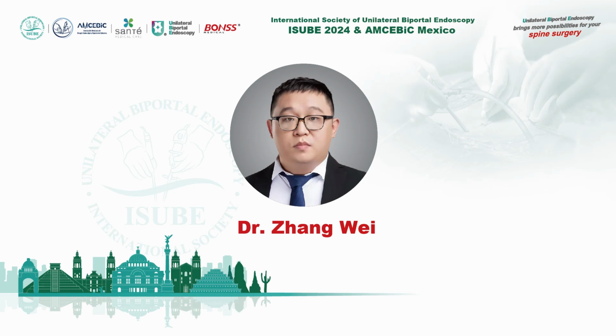Today my topic is also the thoracic case. The content includes the indication, anatomy, approach, portals, position, and operation, the video, and conclusion. In my center, the indications of UBE thoracic include OLF, disc herniation, and OPLL.